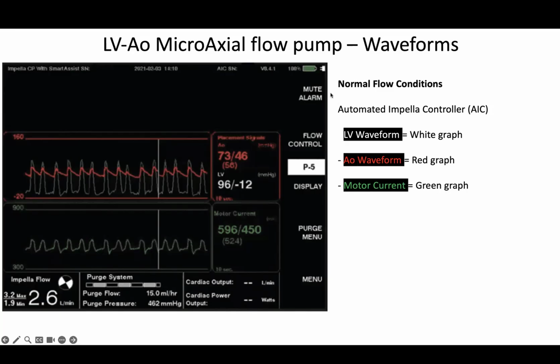And then you have your control, right? So you have the thing that you push, and then you can use this menu. The most important things will be alarm review, performance levels, and your overall menu, right? Any questions about your normal console here? No. Okay.